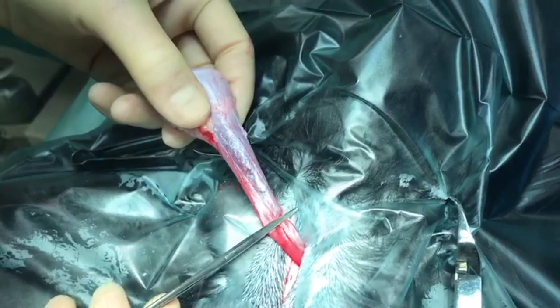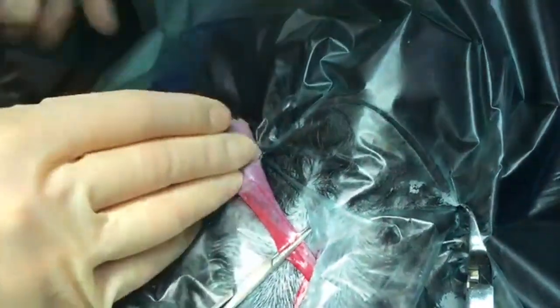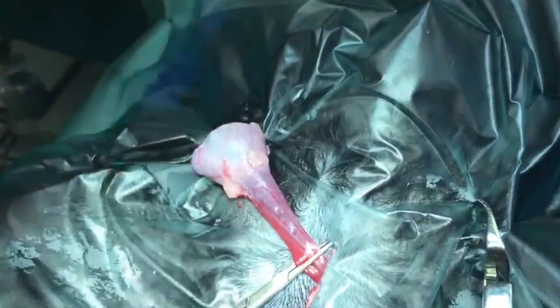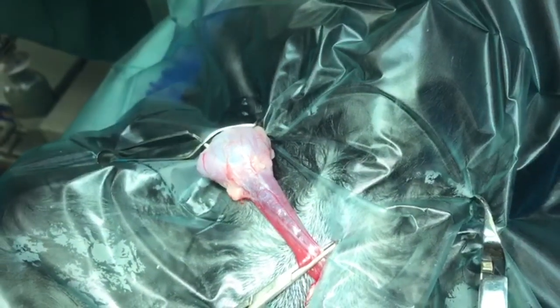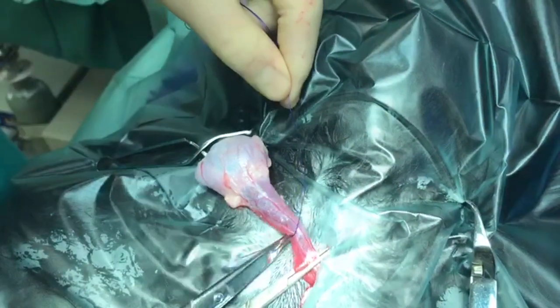Traditional ligatures are mechanically weak. You need a lot of tension to tighten them and then they lose a lot of that tension when the pull is released. Constrictor knots tighten more easily and do not release the tension held in the first throw.